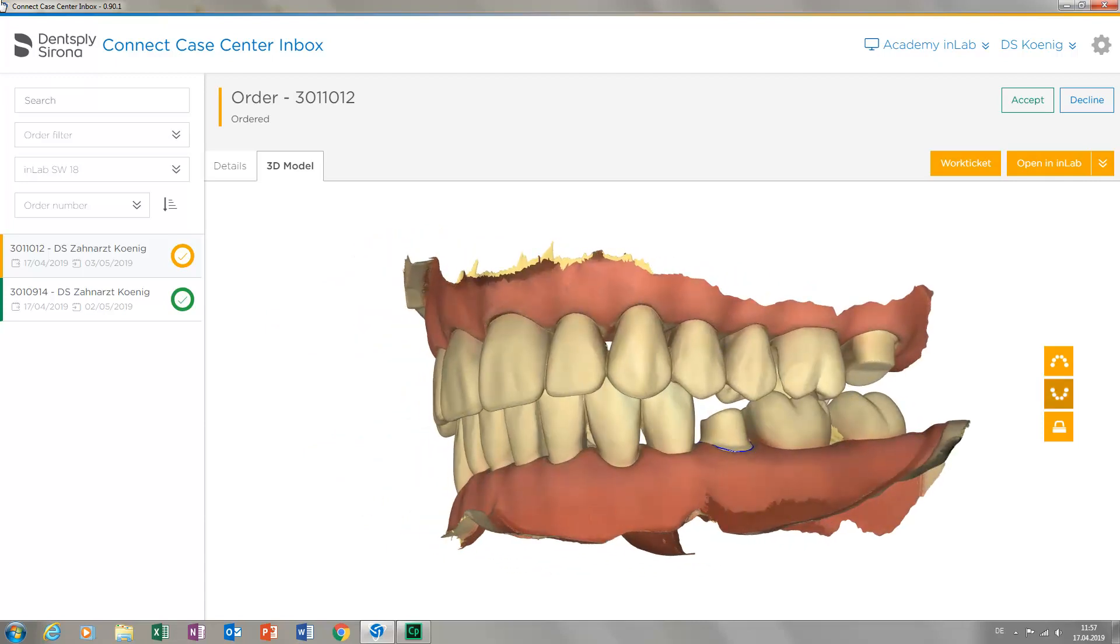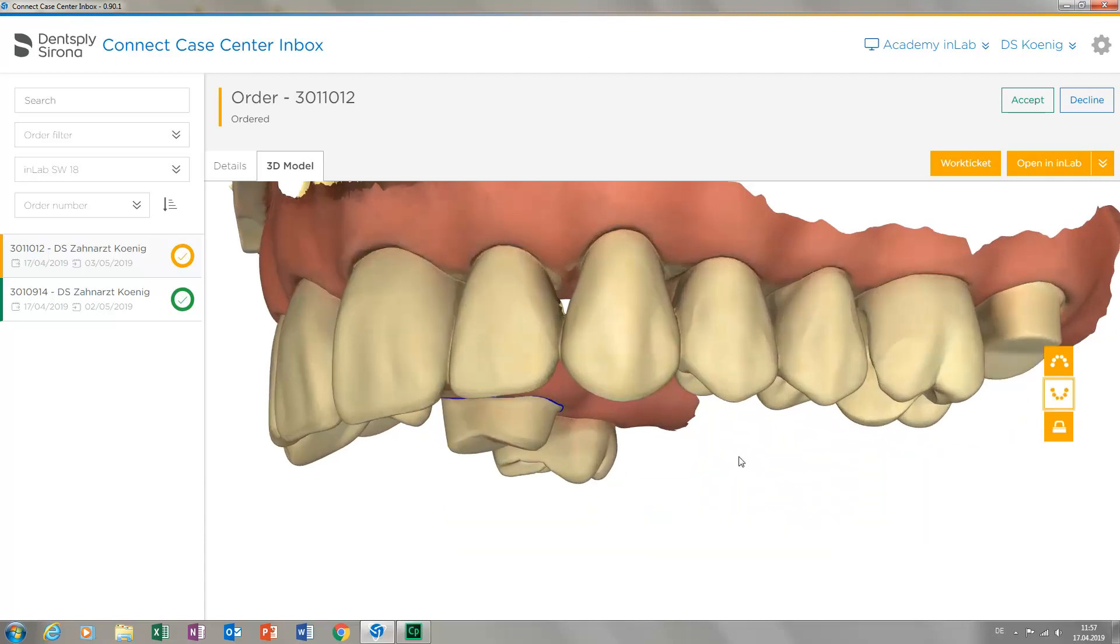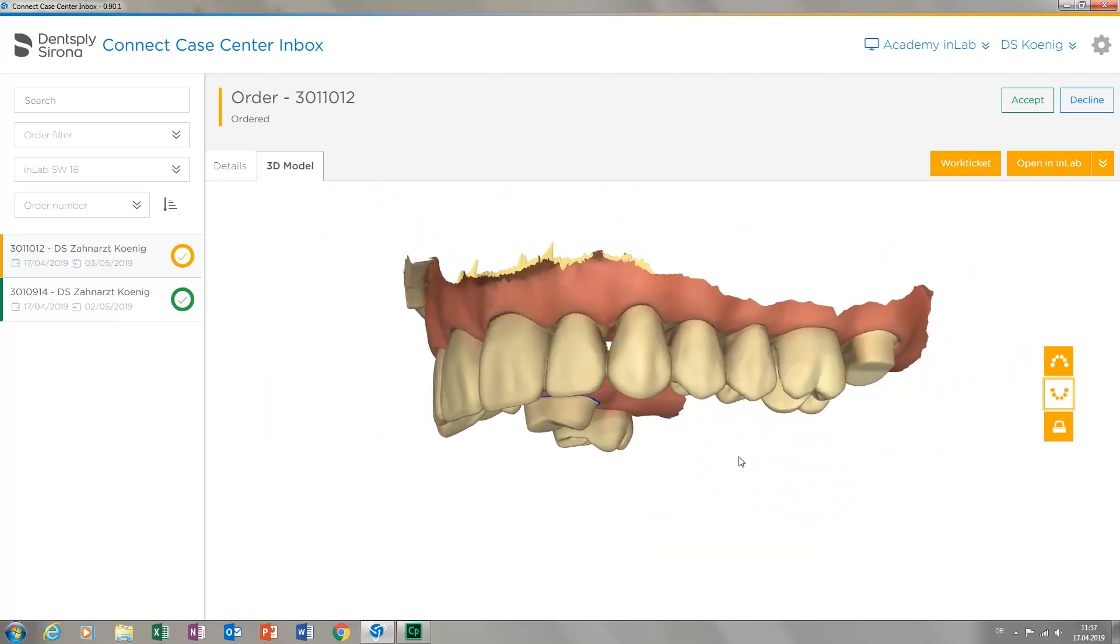To check the individual preparations, for example, it is possible to hide the lower or upper jaw. In our case, we will disable the lower jaw and view the bridge preparation in the upper jaw.